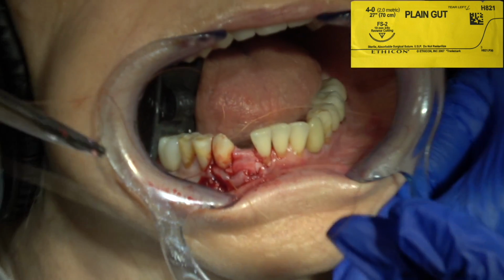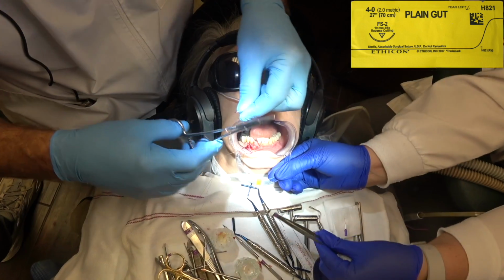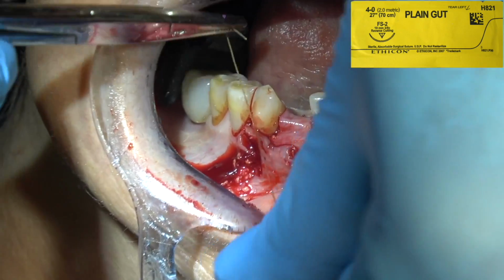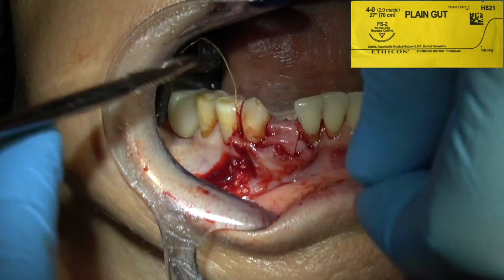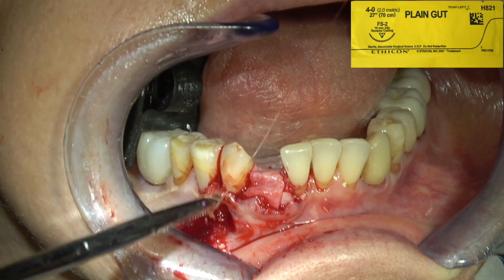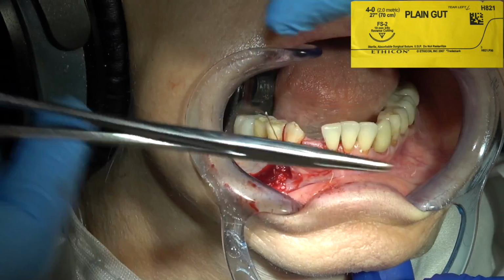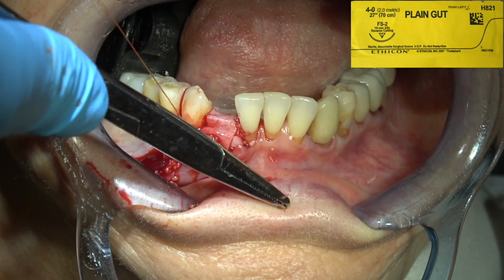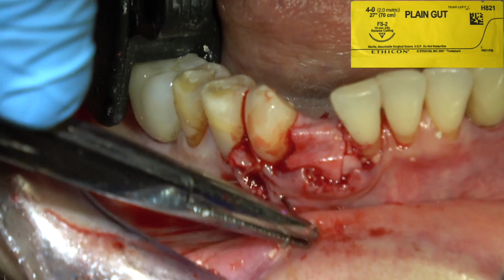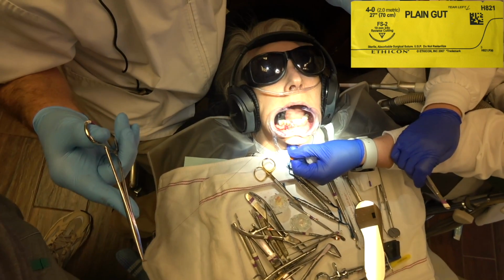There's no magical way of suturing. You just want to close it up so the tissue is covering as much as possible the resorbable collagen membrane. Now, I do a lot of implant placement and extraction where there's not primary closure of the flap. You've just got either platelet-rich fibrin or resorbable collagen membrane over a fairly significant section of open flap, and that works real well, either one.